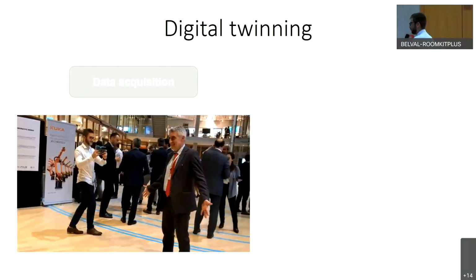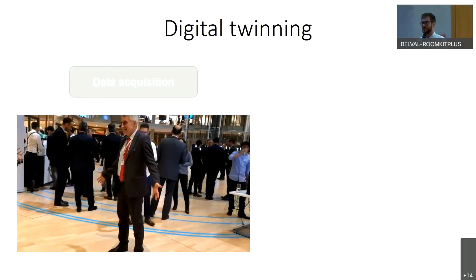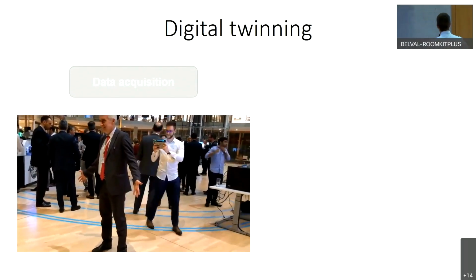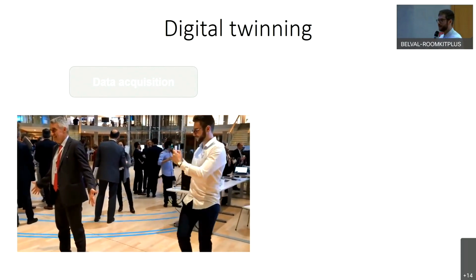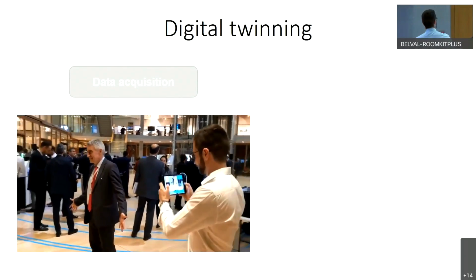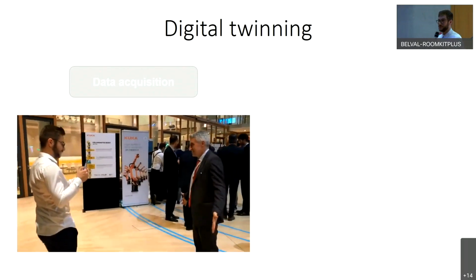To do so, we need to acquire some data first. For our application, we will use a surface scan. So we used a depth camera, which is nowadays present on every tablet or smartphone. Then we circle around the patient. This will allow us to reconstruct the 3D shape of the patient.